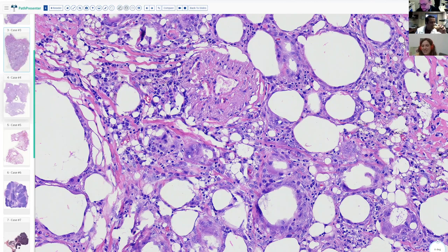I had one case also, and they still don't believe me, because we received it as a mass that was not in the appropriate lobe. The image was like that, and it took me a while to realize what was happening. I saw the holes and couldn't see what was going on.